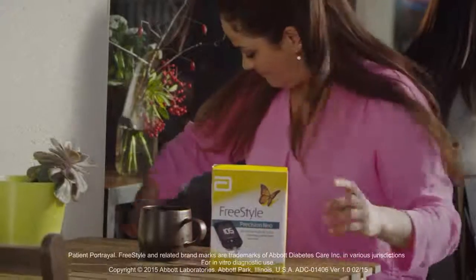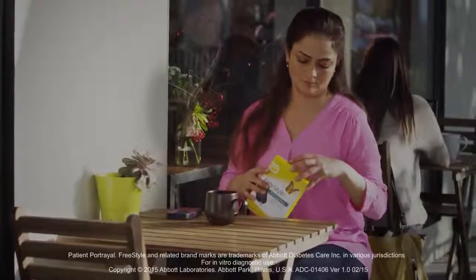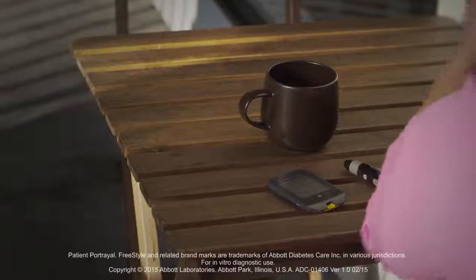Learning how to use your Freestyle Precision Neo blood glucose monitoring system is easy. Your kit contains everything you need to quickly begin using your meter. Let's get started.